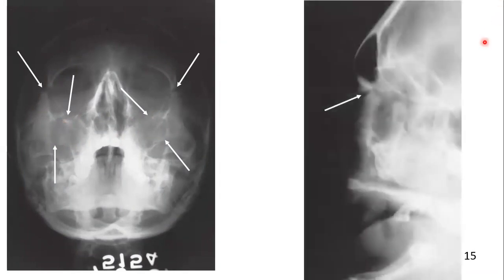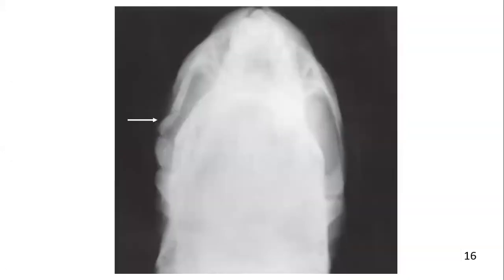In this other radiographic picture, this is a lateral skull view that illustrates a Le Fort III fracture or craniofacial separation. The fracture line shown by arrows separates the midface from the cranium. This submental vertex view demonstrates a zygomatic arch fracture.